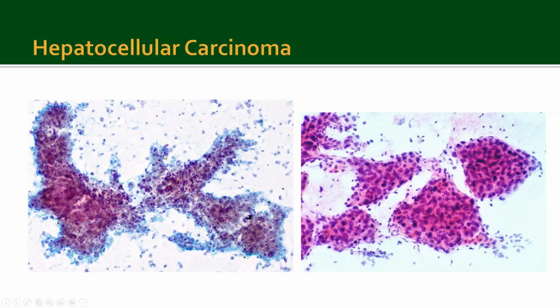There's also scattered atypical naked nuclei around. The actual architecture of these is a bit irregular, and even on the image on the left, almost looks a little bit papillary to me, or pseudopapillary, because I don't see a core, but the rounded finger-like projections on the edges.